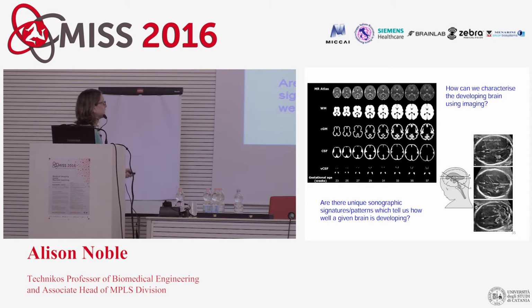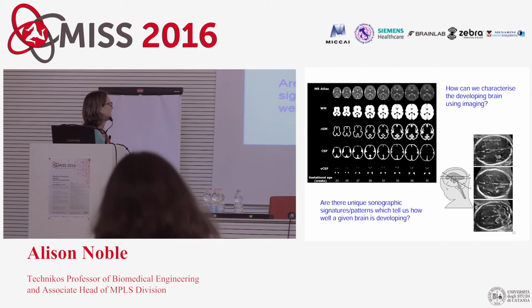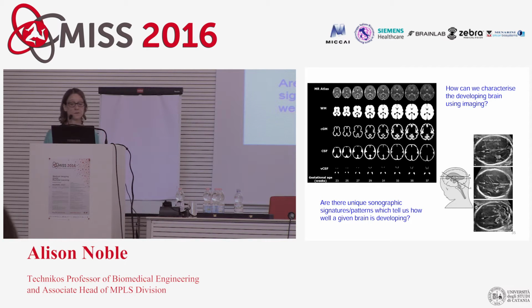So if you're working with data of this kind, what you're really asking, translating to the scientific point of view, is: are there unique sonographic signatures or patterns which tell you how well a given brain is developing? It was an unknown question before we started to do some of our work, particularly looking at interior patterns, but we decided to see if we could get machine learning to help us.